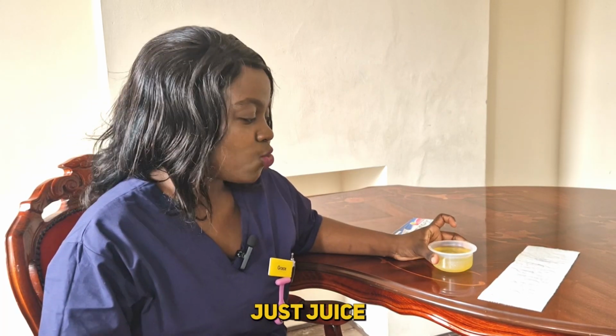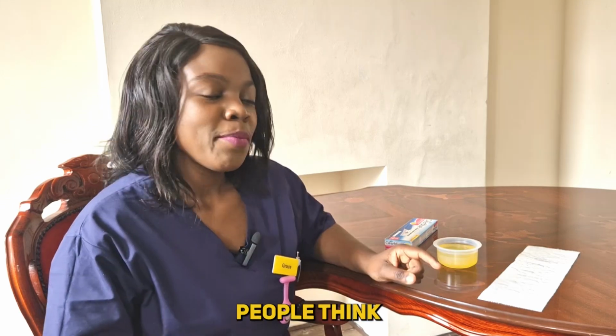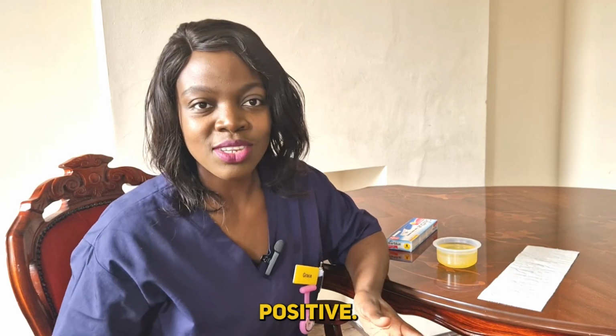If it does that, then there's a high chance that it's going to produce the results that you want. So now we go to the testing part. So how do we test it? So guys, disclaimer, this is not urine, this is just juice in the color of urine. I'm not going to be using any urine in this process. People think that it's urine. It's not urine. It's just some juice that I'm going to be using. So we don't expect the results to be positive, definitely.